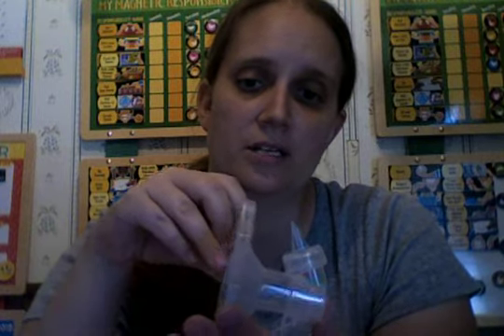Now I'm going to show you a little trick too. Depending upon how you use it, you may want to replace these maybe once a month. If you're not using these very often, maybe not quite as much as that. If you get into a bind and you don't have these, you can take this. This is the Medela valve thing with the little thing on it. These are so much cheaper. These are $16 for 4, so $4 a piece. That's expensive, but I do like them better.